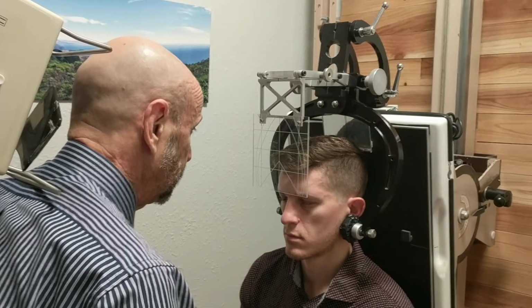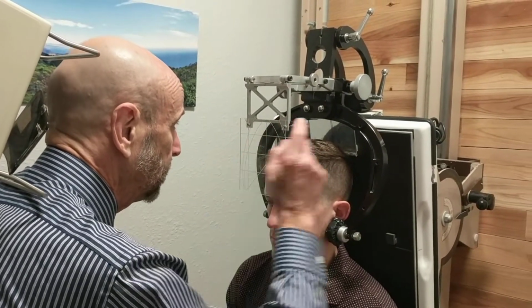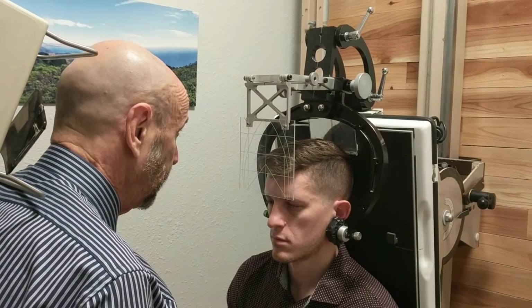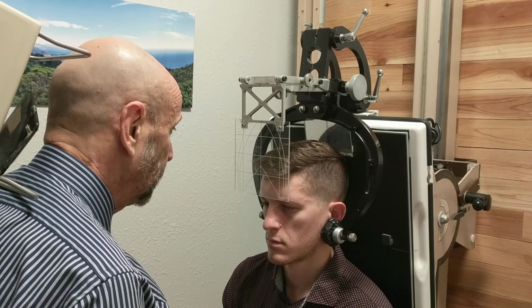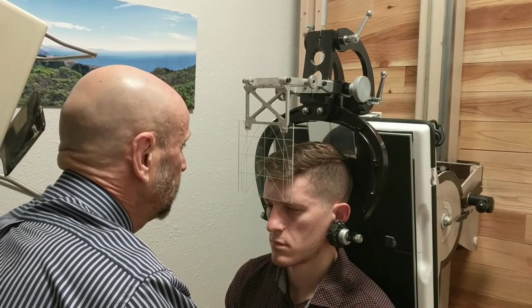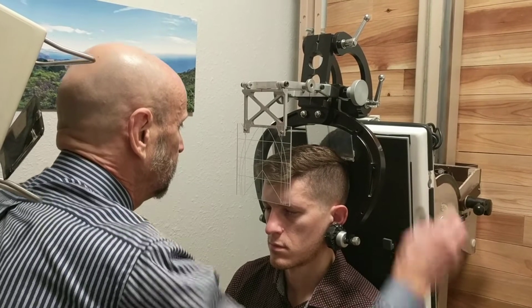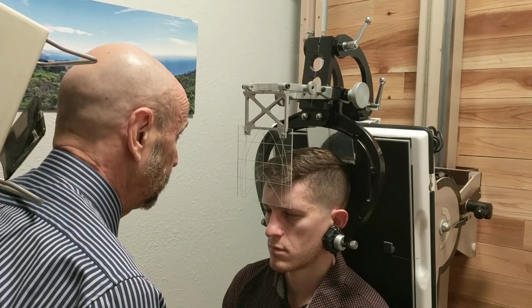The next thing then is I'm once again closing one eye and sighting down this line on the face mask, superimposing it over the mirror line in the back, and then seeing if that bisects the glabella squarely. And it doesn't in this case. So now we don't have to move the chair sideways. All we have to do is loosen the head clamps and rotate the chair, making sure that the patient moves as a unit. And that's the full alignment there for the Nasium.